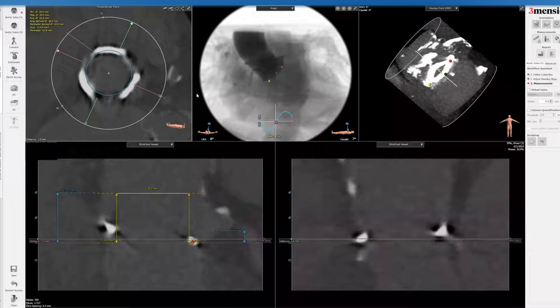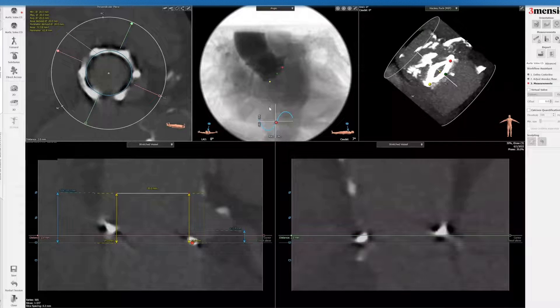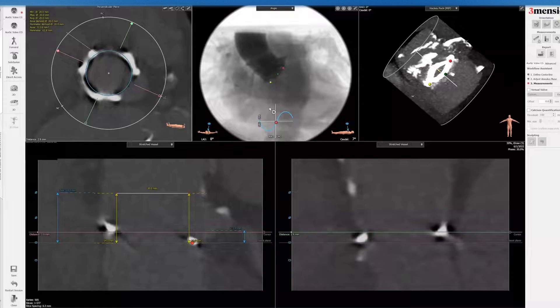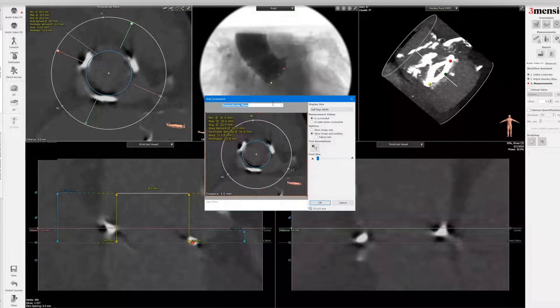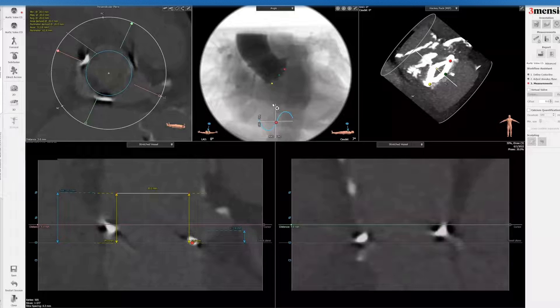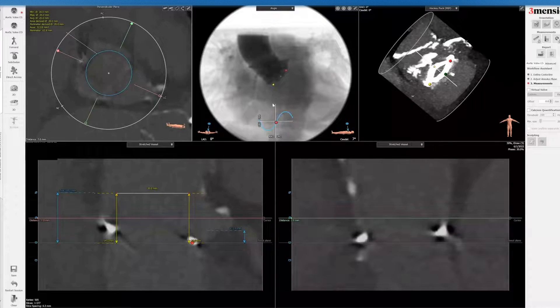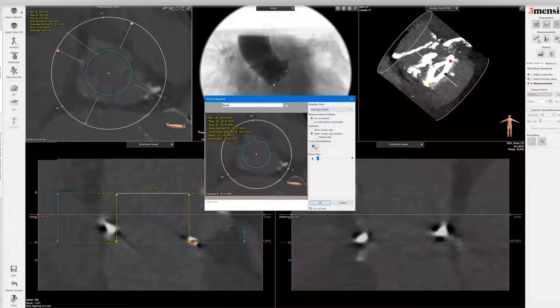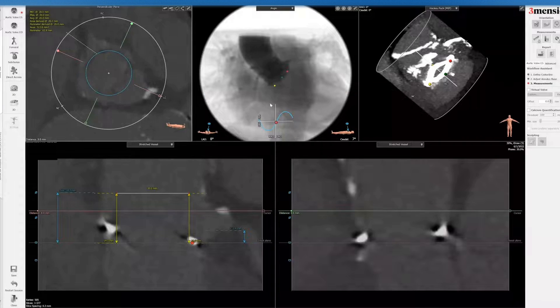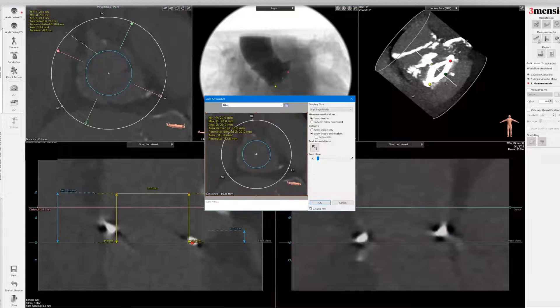Now, as I mentioned, with this externally pericardially mounted valve, the frame circle will not be representative of the actual leaflet. So if the leaflets are very bulky on echo, be aware of increased coronary obstruction risk even though your VTC distance might be favorable. Correlating echo, CT, and fluoroscopy angiography is going to be extremely helpful with these types of prostheses — especially with externally mounted leaflets like the Mitroflow and the Trifecta.